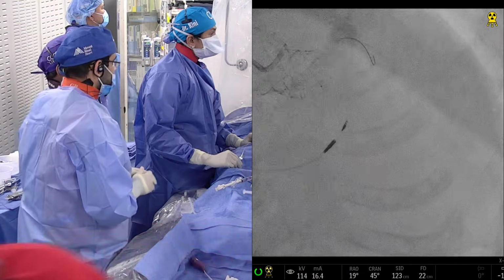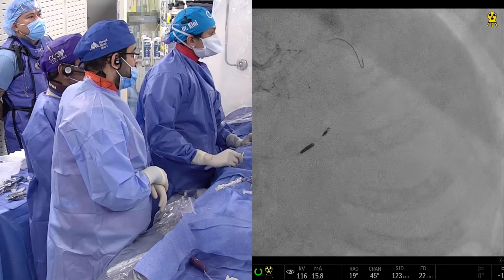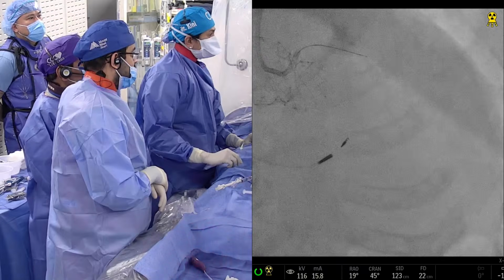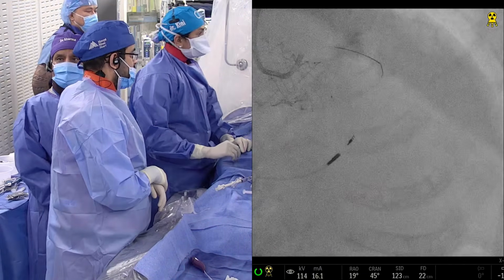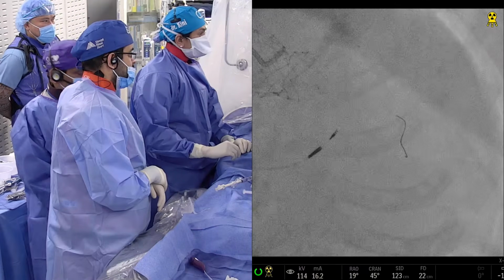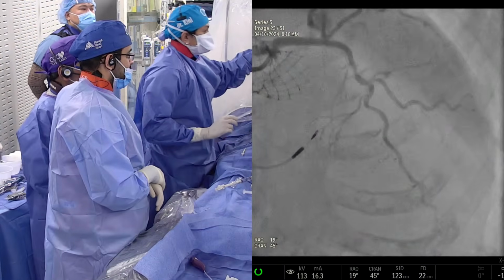So now here, the wire went in and has pushed the guide out a little bit. Yes. I was surprised. No, it's a circle. There is a circle already. Okay. No, it's okay now. So this is the case. You will not do the direct wiring. Yeah, here, this is the Fielder run through. Fielder. Okay. Yeah, look at this.